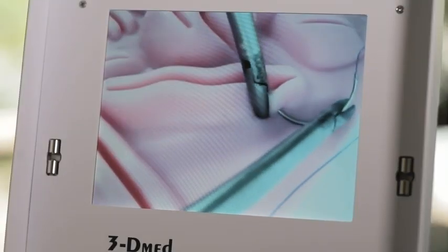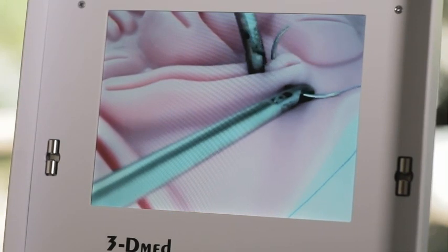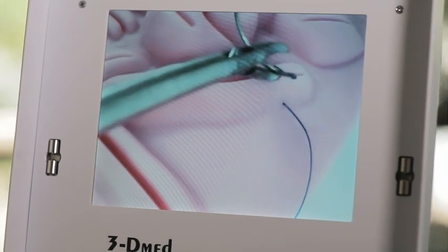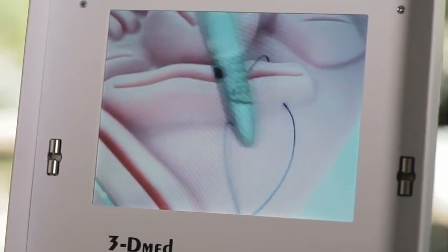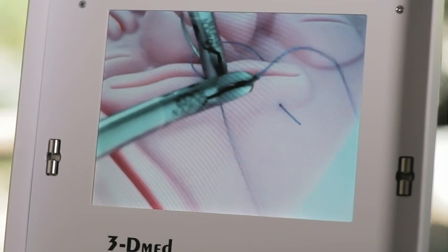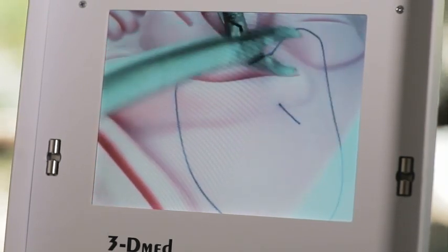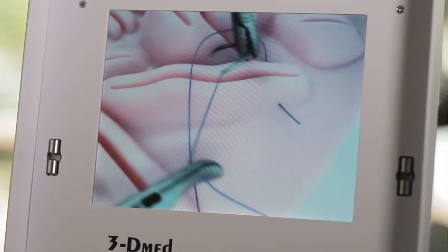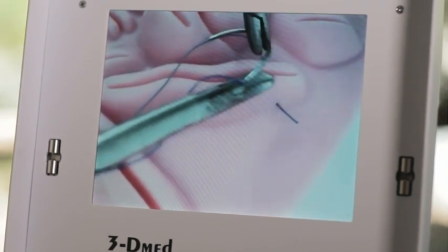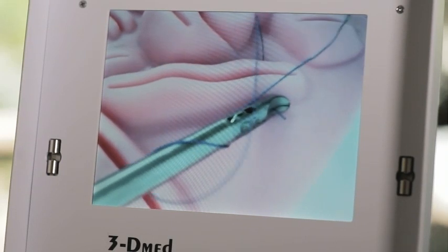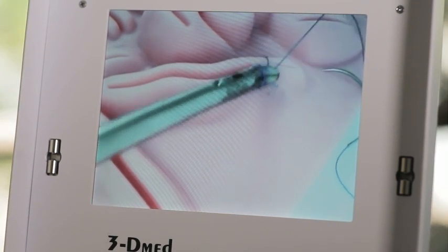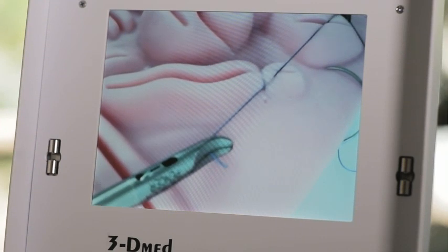We're going to pass the suture through the tissue now and show a running stitch. If we were closing the bladder, this running stitch would be used through one layer, then we would come back in the opposite direction. I will begin tying my knot. I'm going to pull the hub towards me so I can wrap around the needle driver one, two—there's a surgeon's knot. I'll pull this down, drop my needle in view, and tighten the rest. I'll disgorge it from my driver and tighten it down.